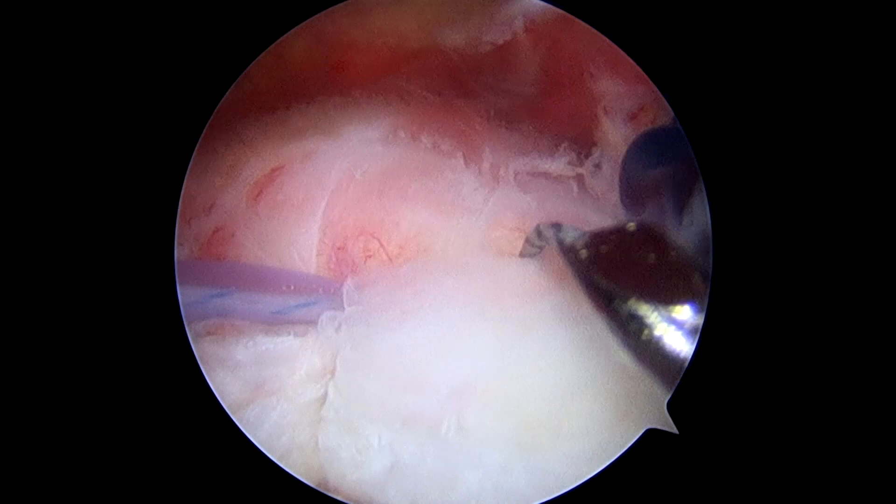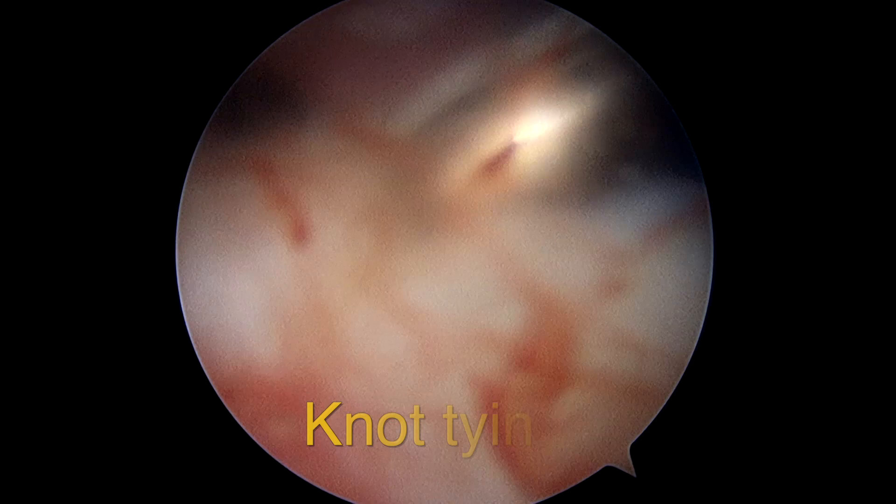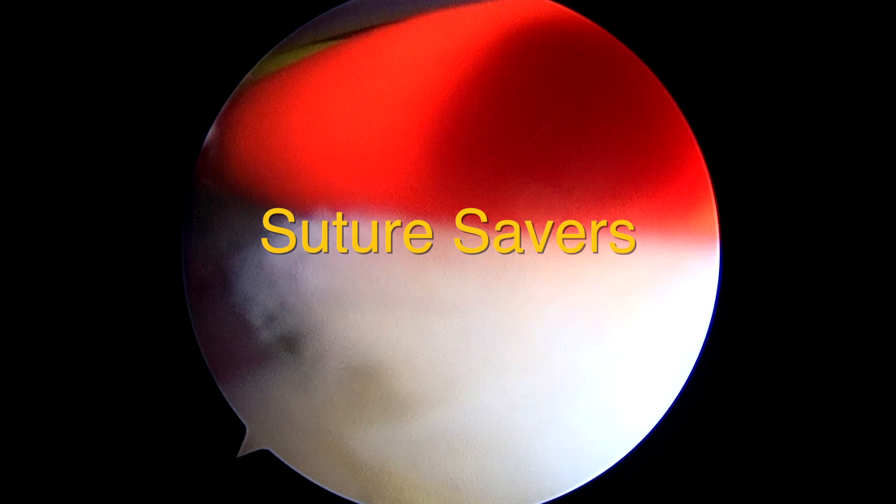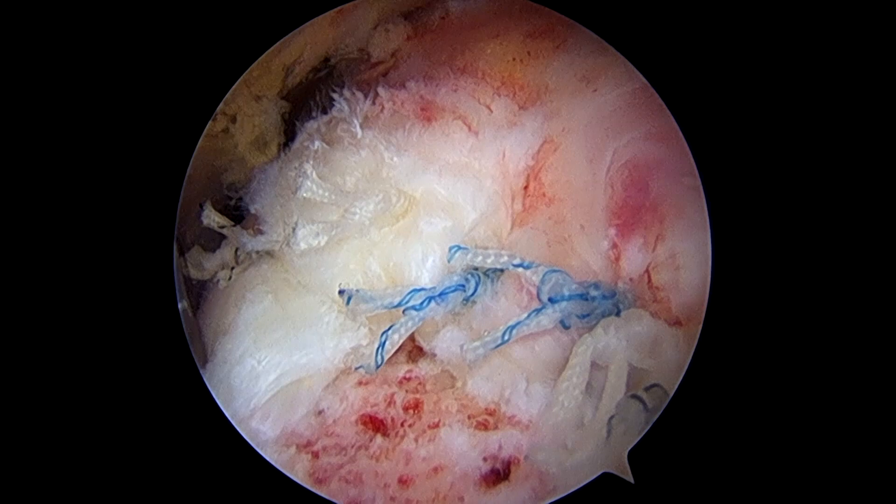Here you see the suture shuttle coming through — it's retrieved out inside the blue cannula, loaded with the suture, and carried back through the cuff from bottom to top. We tie the knots such that they sit on the top of the torn rotator cuff and compress the cuff down to the prepared bone in the footprint. We use the crochet hook to carry the sutures inside and tie them individually.